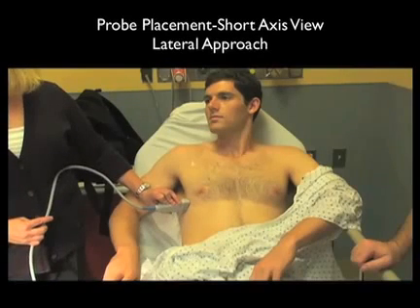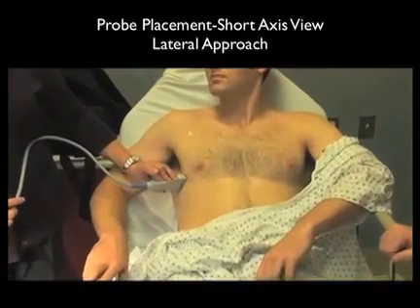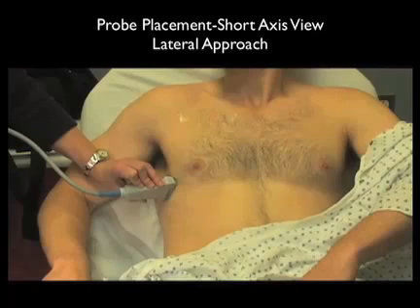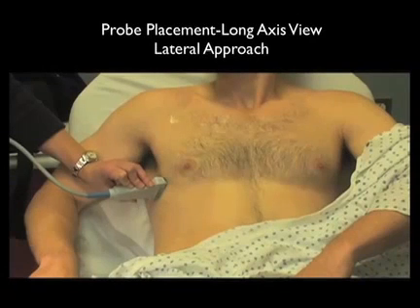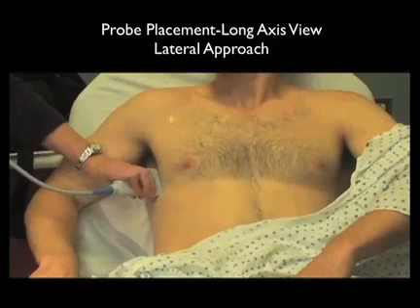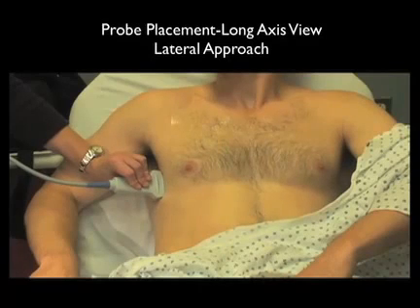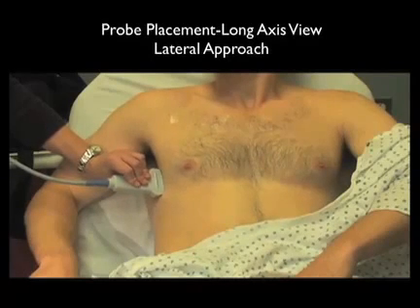If no lung is seen on the anterior chest wall, one can size out a pneumothorax by looking in the lateral positions as shown here. Notice the probe on the lateral chest wall in the short axis configuration between the ribs. If lung is seen here laterally, but not anteriorly, this would tell you it was an incomplete pneumothorax. We can complement the short axis view by locating the probe into the long axis configuration with the marker dot towards the patient's axilla to further examine into these lateral areas of the chest wall.